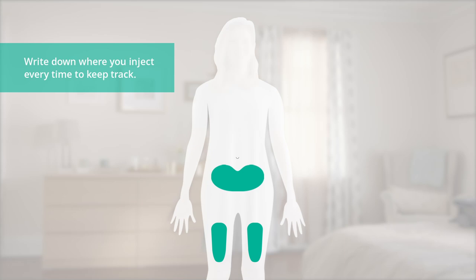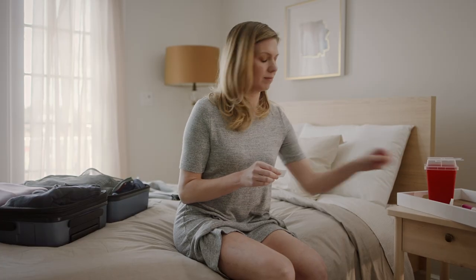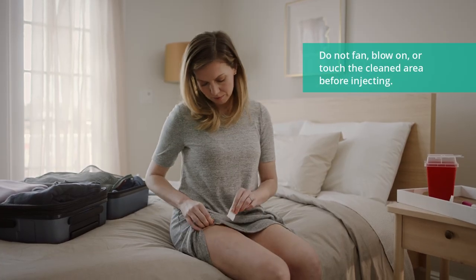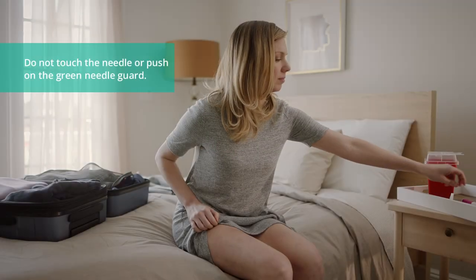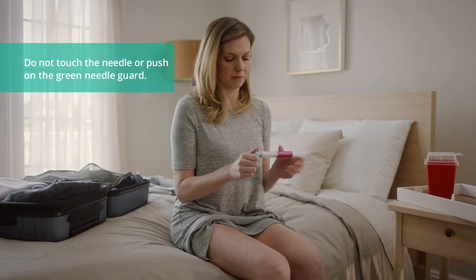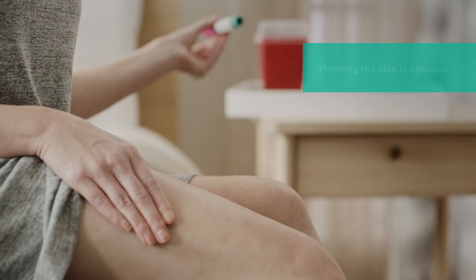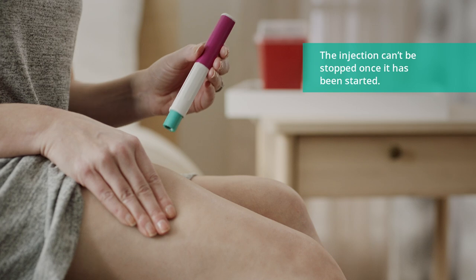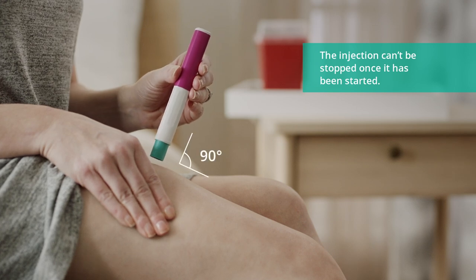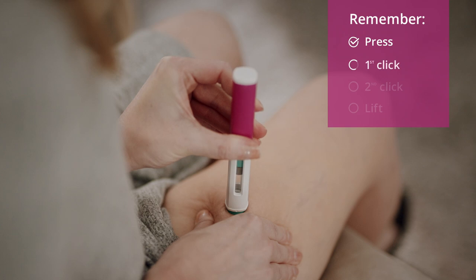Once you've chosen your injection site, wash your hands well with soap and water. Clean the injection site in a circular motion with the alcohol wipe and let it air dry. It's time to inject. Remove the cap. You may gently pinch the skin surrounding the injection site. Line up the pen at a 90 degree angle with the injection site. Press down firmly. You will hear a click signaling that the injection has begun.